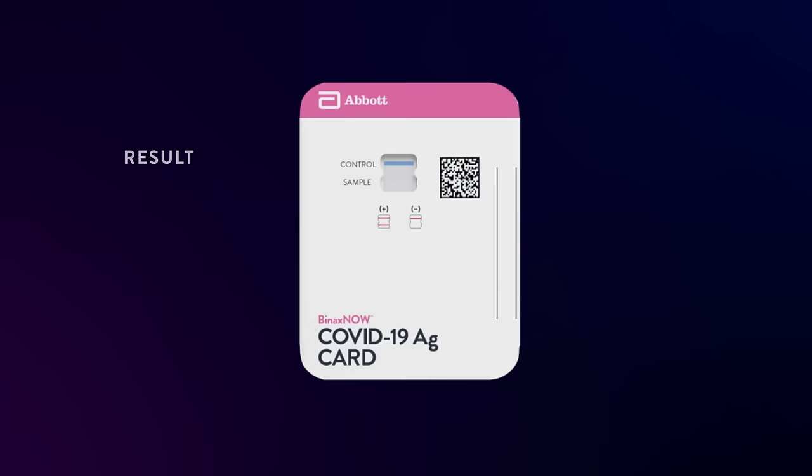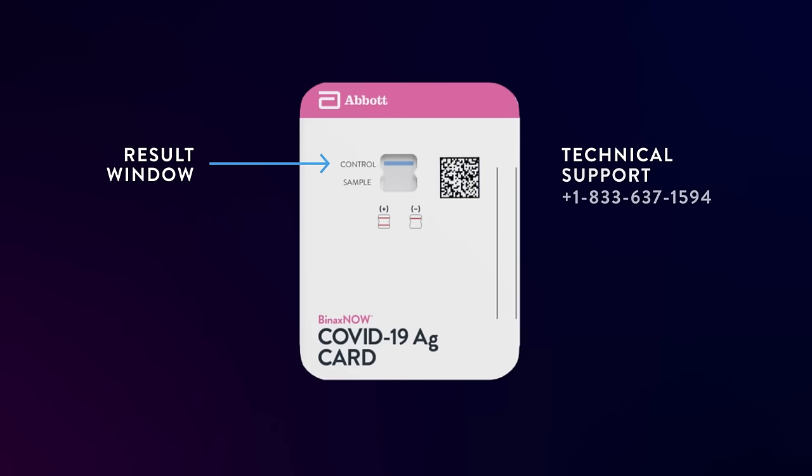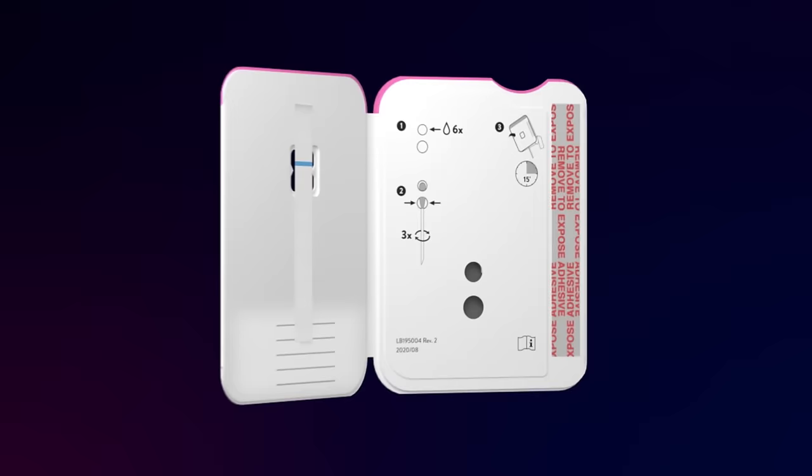Make sure there is a blue line showing in the result window. If you don't see a blue line at the control position before starting the test, do not use the test card and contact technical support.